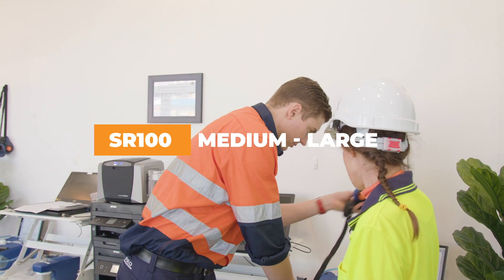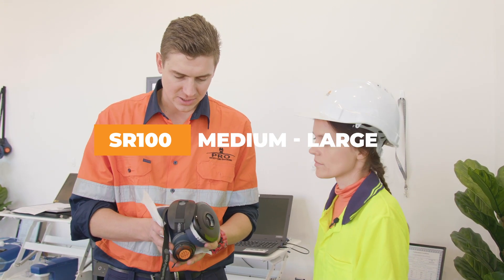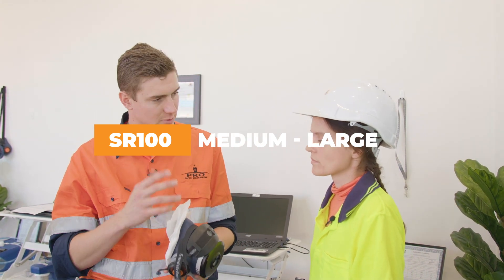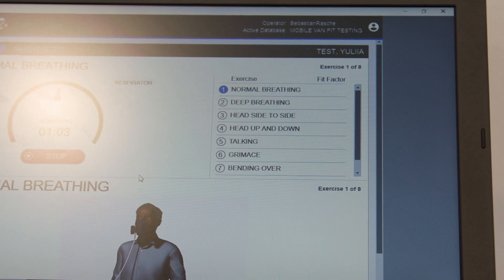What we're going to do for a bit of an experiment is test you on a medium large. I don't think this is going to seal on your face because you've got quite a small face and the mask is quite large, but let's give it a try — just nice relaxed normal breathing.